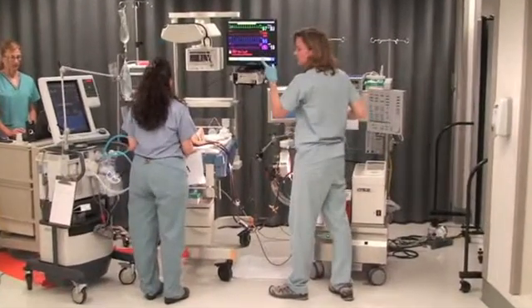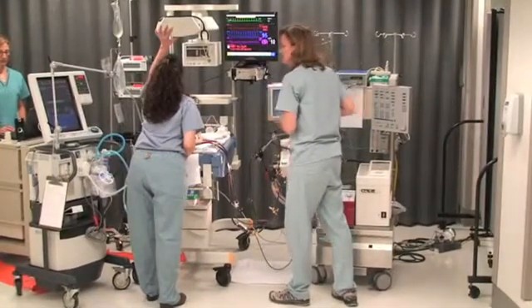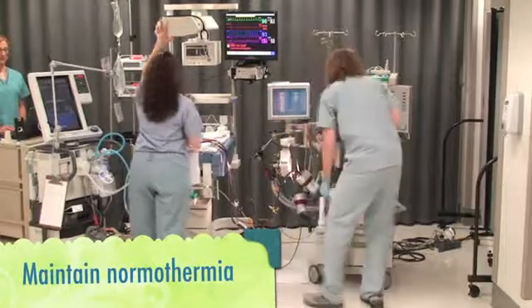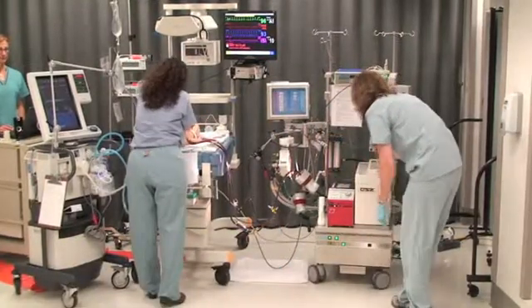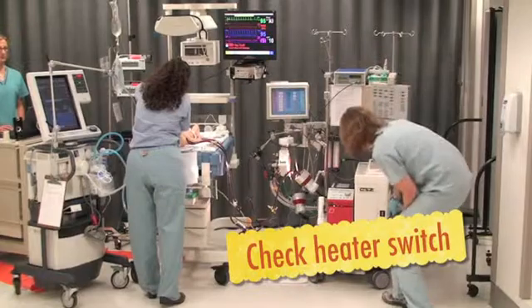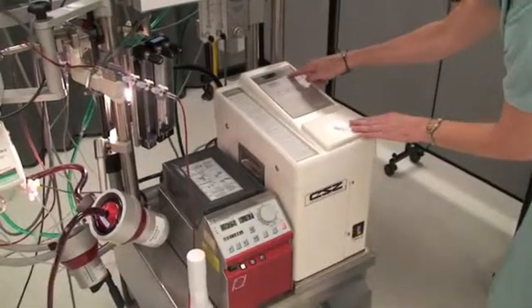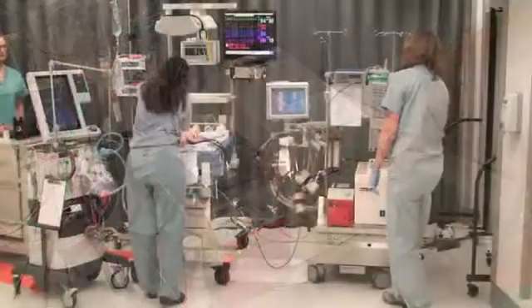Maybe we can turn on the overhead warmer and check the baby's temp too. Alright, the warming's on. I'll get an axillary temp here. The heater's off — the power's on, but the heater's not running.